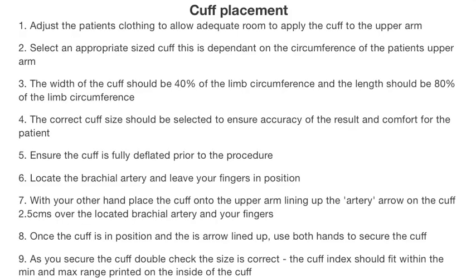It is vital to ensure correct cuff placement to provide an accurate blood pressure measurement. Firstly, adjust the patient's clothing to allow adequate room to apply the cuff to the upper arm. Select an appropriate size cuff — this is dependent on the circumference of the patient's upper arm. The width of the cuff should be 40% of the limb circumference and the length should be 80% of the limb circumference. The correct cuff size should be selected to ensure accuracy of the result and comfort for the patient.